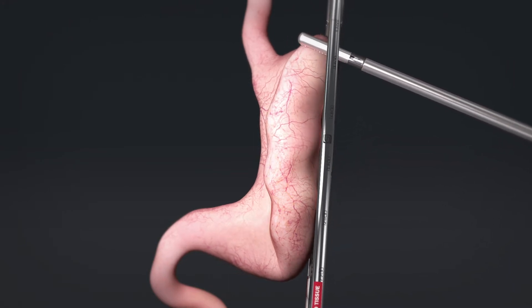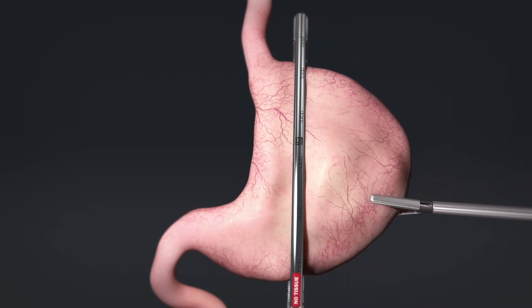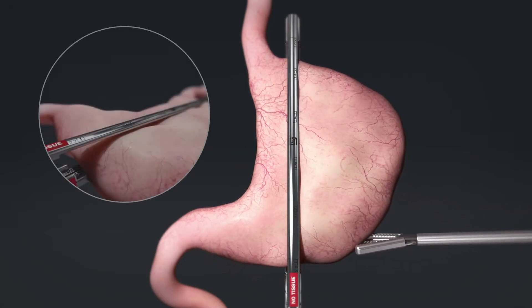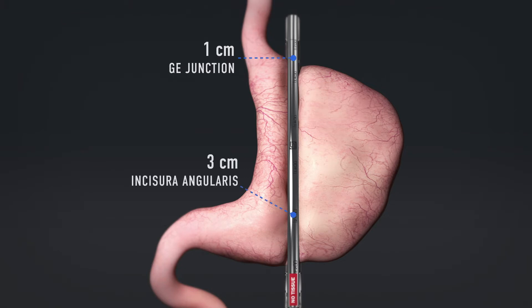Insert the Titan SGS stapler into the abdomen. Clamping as you go, manipulate the entire stomach through the stapler from the fundus to the pylorus region. Respecting the key anatomical landmarks and the sizing bougie, the resulting cut line should be approximately one centimeter from the GE junction, three centimeters from the incisura angularis, and approximately four to six centimeters from the pylorus.